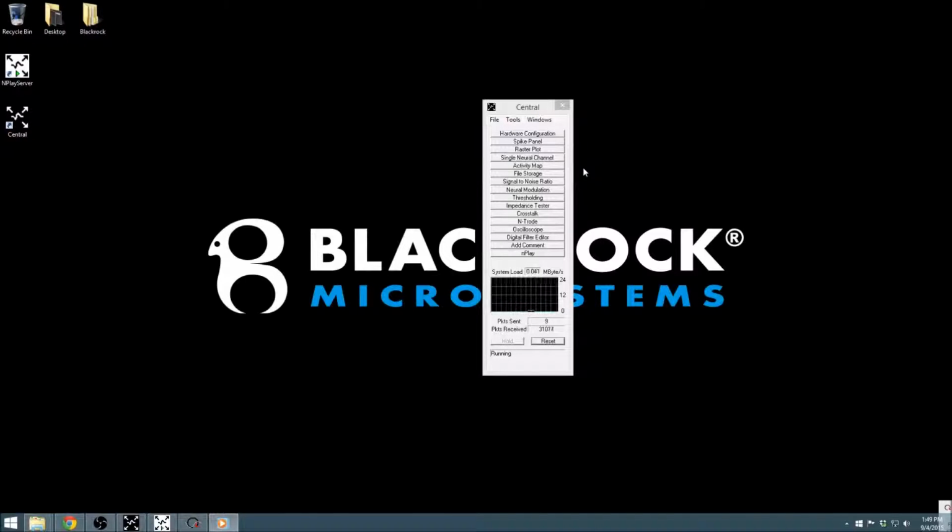This video series covers the basics of working with our Central software suite. If you don't have Central up and running yet, you may want to check out our Getting Started video for more information. This tutorial covers the use of file storage. The file storage application within Central is used to save recorded data to the local computer. While it has a relatively simple user interface, this tutorial will cover all of the options available.